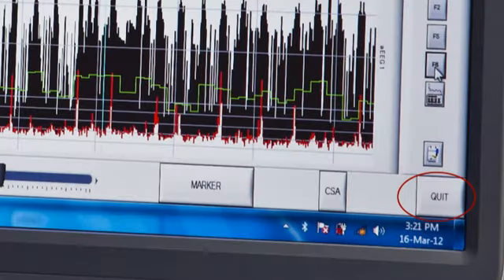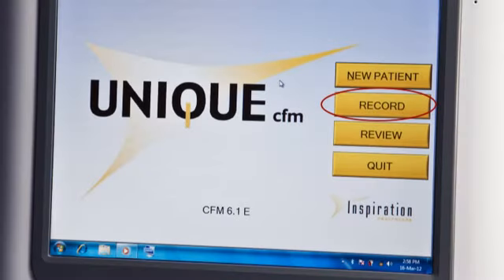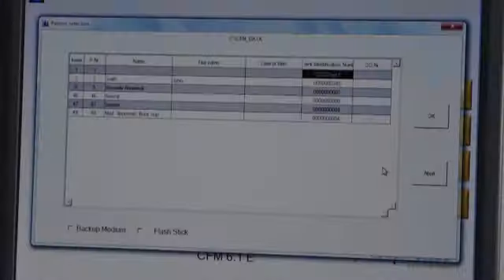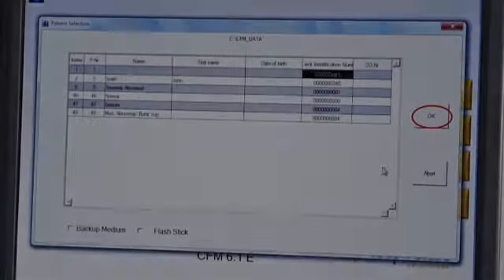To end review and continue recording, press quit. To start recording under an existing patient, click on the record button on the master screen. Select your patient from the list and click OK.